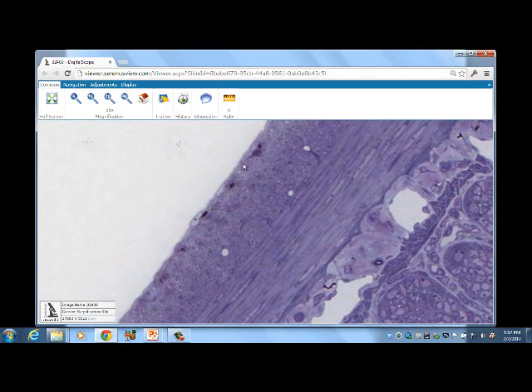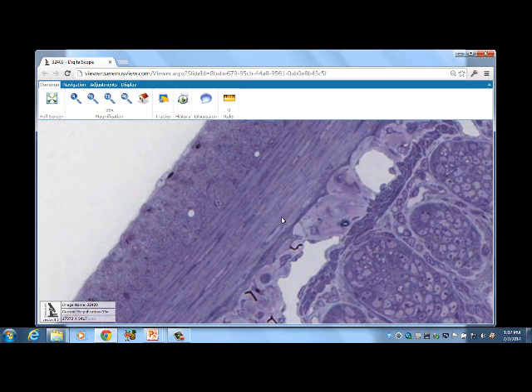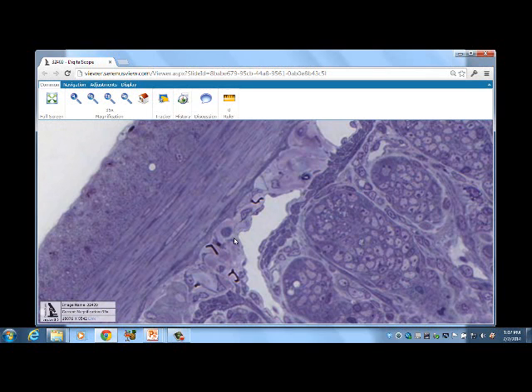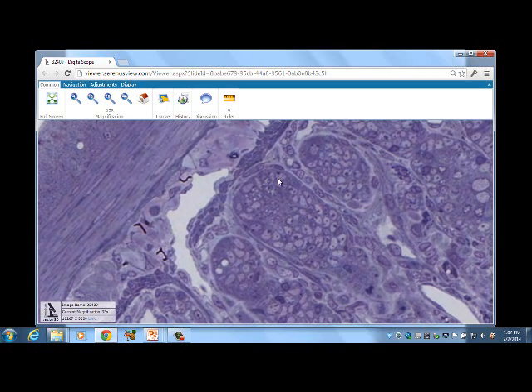You can see the nucleus of the mesothelium, and then this is smooth muscle, and smooth muscle here. This is circular muscle and longitudinally disposed muscle. Then this is connective tissue. Here we see a fibroblast. This is connective tissue running through there, and then here's a muscle layer. This muscle here marks the beginning of the mucosa.